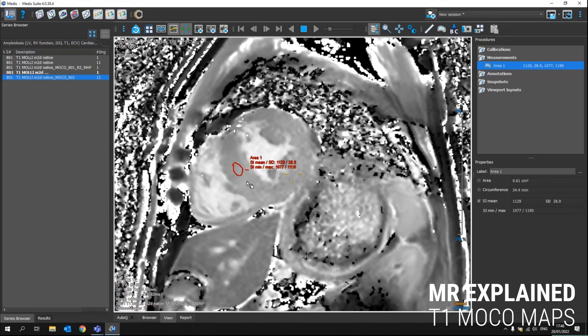But if you would like to get the T1 values for different segments, you can still open it as usual with the maps in the different applications like QMAS or QMAP.